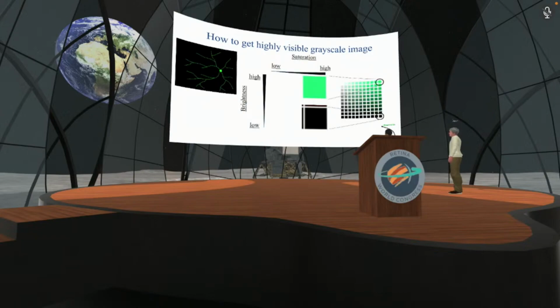When the retinal blood vessels are visualized with fluorescence, the surgical image consists of two colors, the green of the blood vessels and the black background. So the surgical image already has a big difference of brightness and is highly visible.